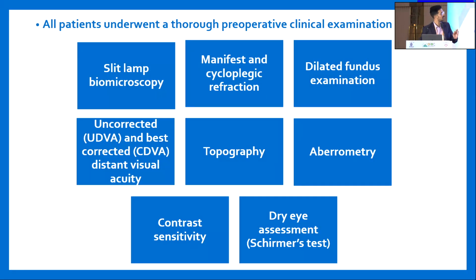All patients underwent a thorough preoperative clinical examination, which involved slit lamp biomicroscopy, manifest and cycloplegic refraction, dilated fundus examination, topography, aberrometry, contrast sensitivity, dry eye assessment, and the uncorrected and distant best corrected visual acuity.